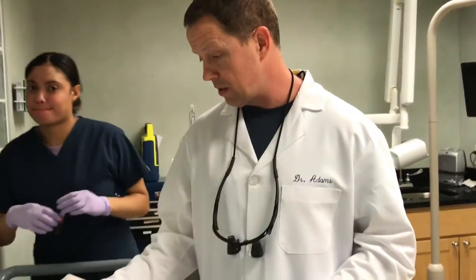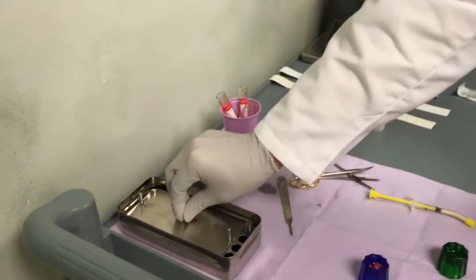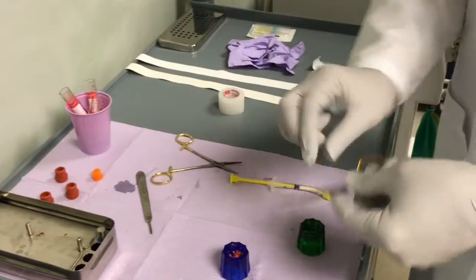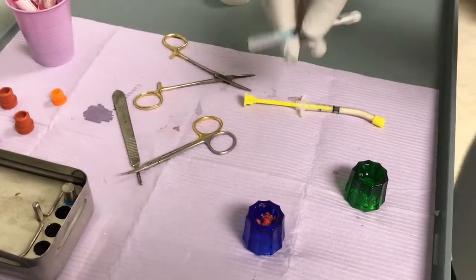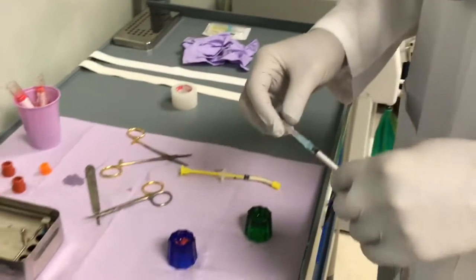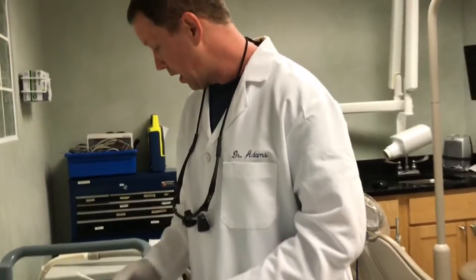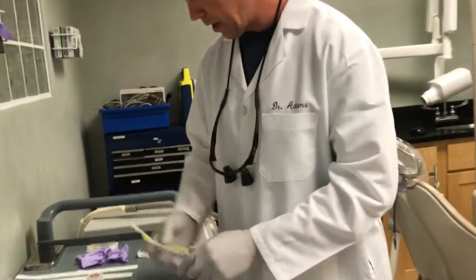When you spin it down, it looks like this yellow, thick consistency that we then mush down on this plate until it's pancake thin. Then we take scissors and chop it up into little pieces. What we have is very concentrated platelets, white blood cells, and fibrin. Then we're going to take our bone graft material, which is right here.